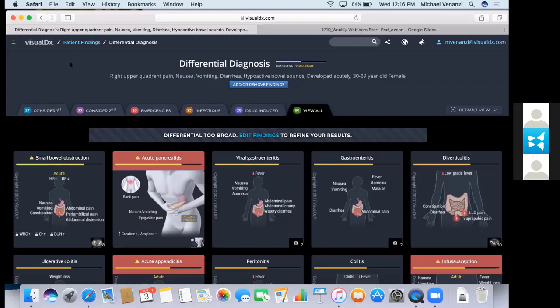In some cases, as you know, sometimes we get a mental block. You may have had a sleep deprived evening, or you've been under a lot of stressors and distractions in a day, and you get a mental block and you can't quickly broaden your differential. This is sometimes quicker than just sitting and trying to rapidly pull it out of your brain.